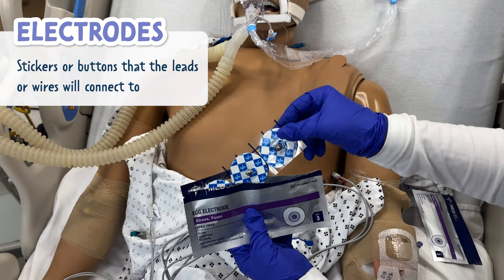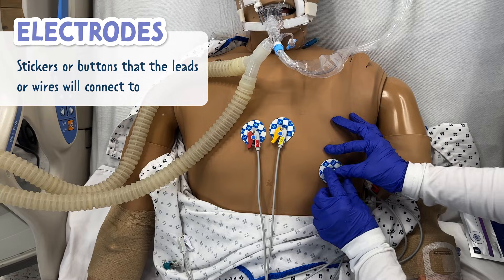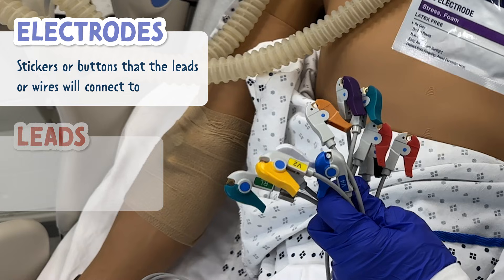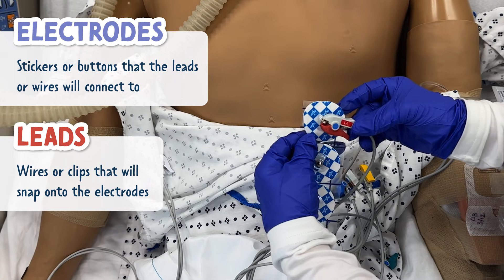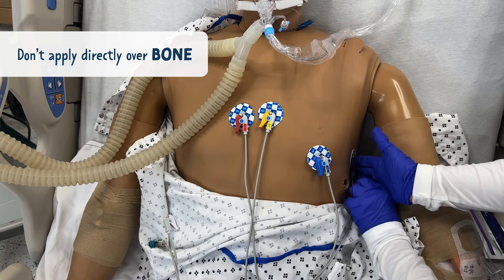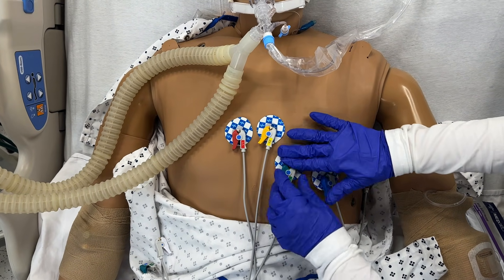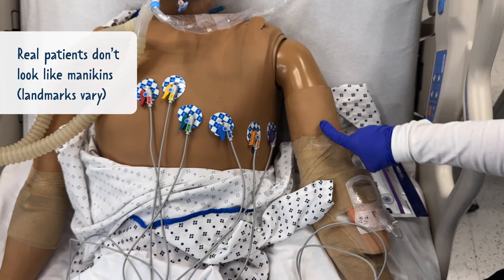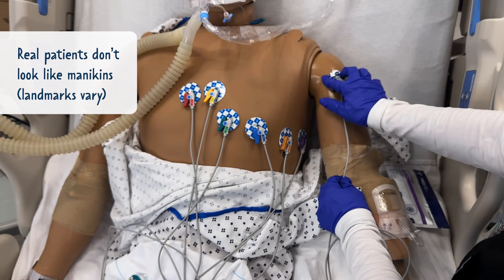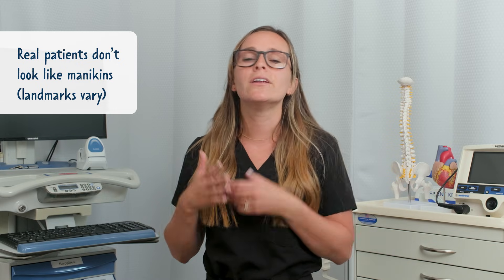Let's talk about the difference between electrodes and leads. Electrodes are the stickers or buttons that the leads or wires connect to — these stick to the chest and body. Leads are the wires or clips that snap onto the electrodes. Before we begin placement, it's important not to place electrodes directly over bone. Also, placement on a mannequin will look a little different than on a real patient, since mannequins have a flat surface while real patients vary based on body type, weight, and other factors.